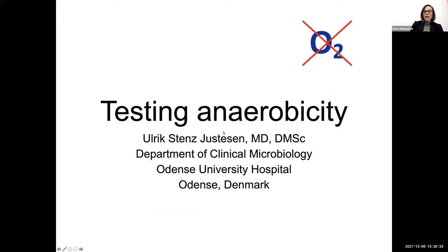Can I just add, while Ulrich gets into gear, that one of the reasons why we're making this work, because some people will wonder why it looks as if it will work when we have failed previously? There are several reasons, and we can go into each of those if you like, but one of them is that the EUCAST steering committee early on decided that there wasn't enough clinical data to allow putting breakpoints all over the place. So we would have to try to identify wild type distributions and then put our breakpoints close to the wild type distributions. And that actually permits reproducibility to a higher degree than if we had put our breakpoints all over the place or in the middle of the distributions or far from the distributions.